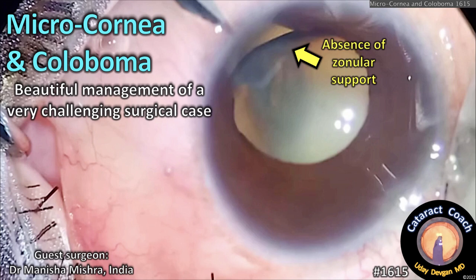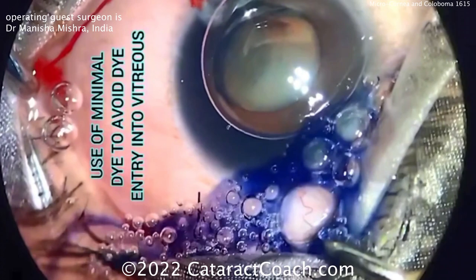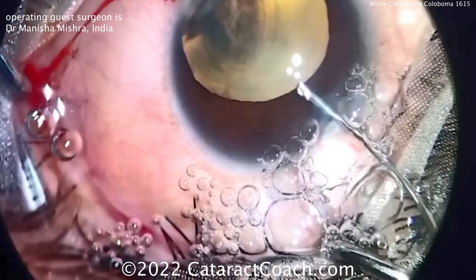cataractcoach.com — microcornea and a coloboma: beautiful management of a very challenging surgical case. Let's take a look. The video quality isn't the best, so forgive that, but how often do you see a case with microcornea and a coloboma? A little bit of trypan blue dye was injected — be careful here, don't inject too much dye.